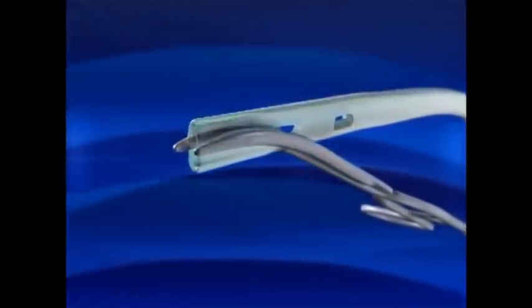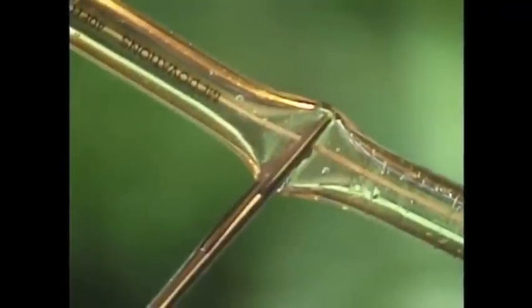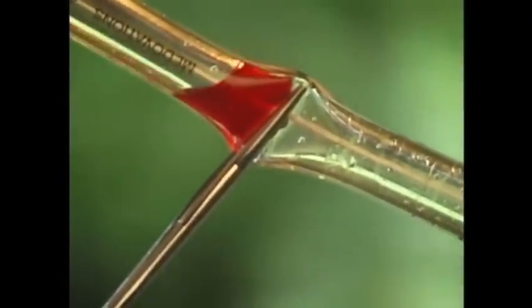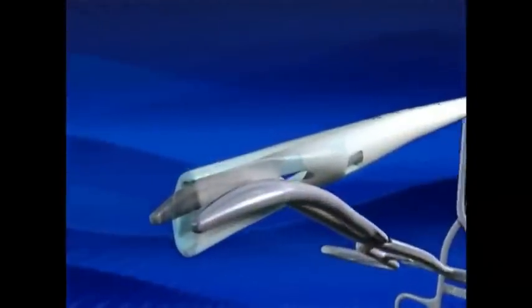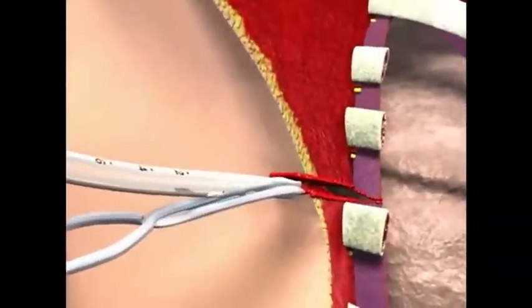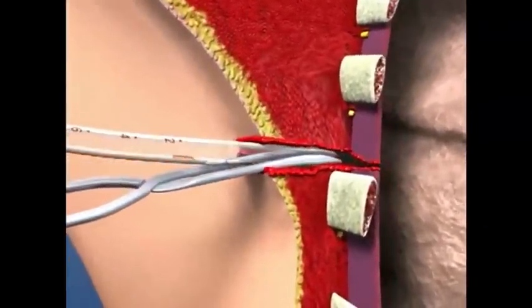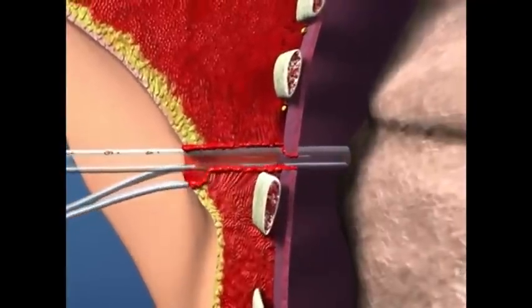Clamp the proximal and distal ends of the tube before insertion. The distal clamp will keep any blood from rushing out before it can be connected to a collection chamber. The proximal clamp will assist in chest tube insertion but may not always be necessary or helpful. Advance the chest tube into the pleural space to the desired length, ensuring all drainage holes are well inside the chest cavity to provide a proper seal and prevent leakage.